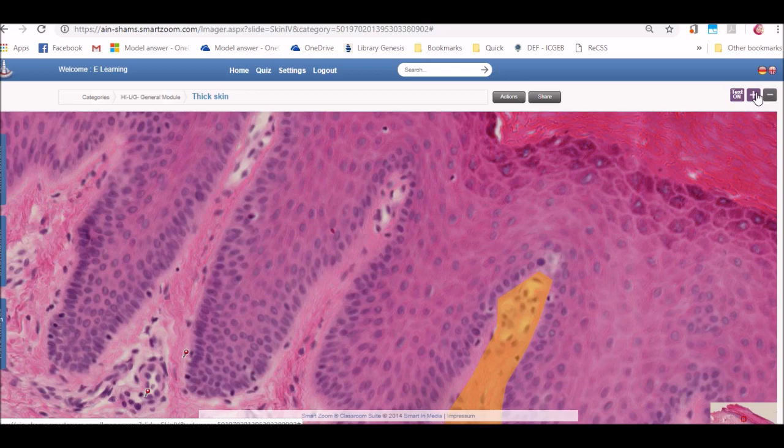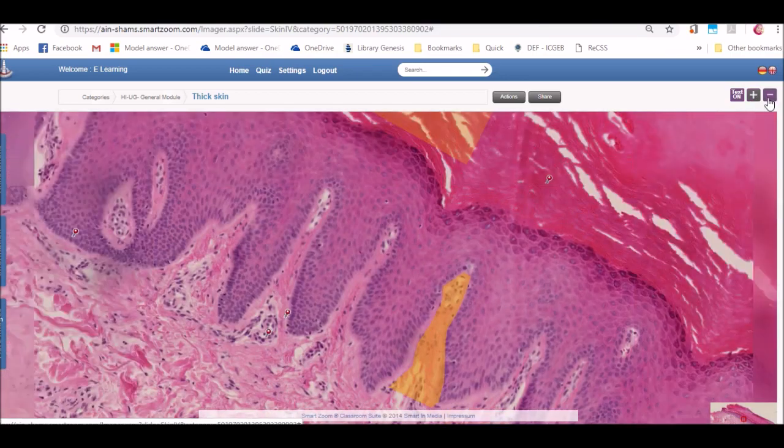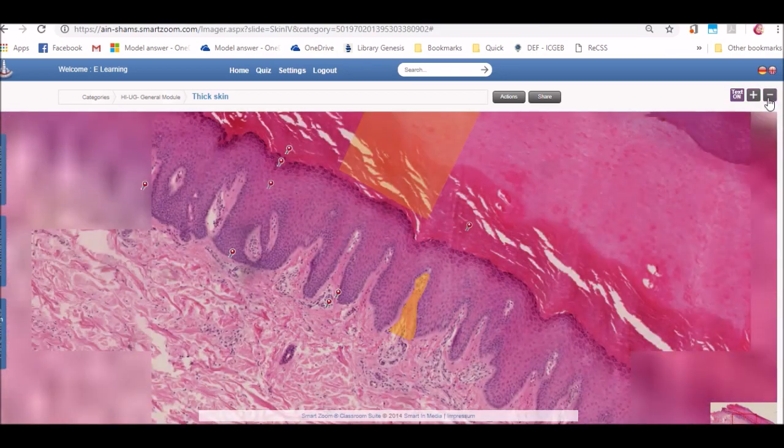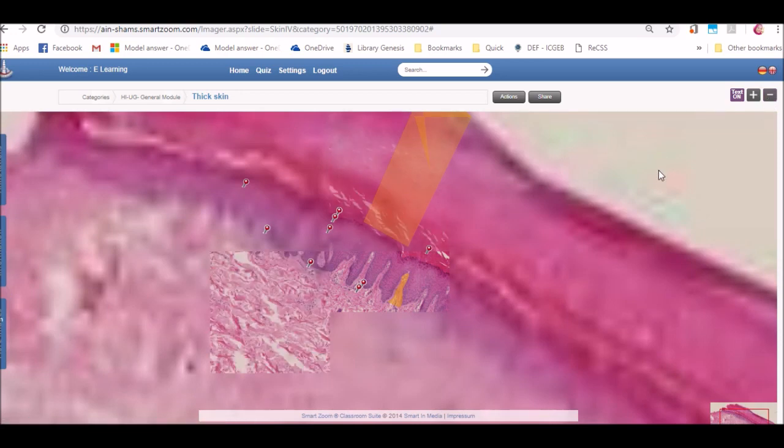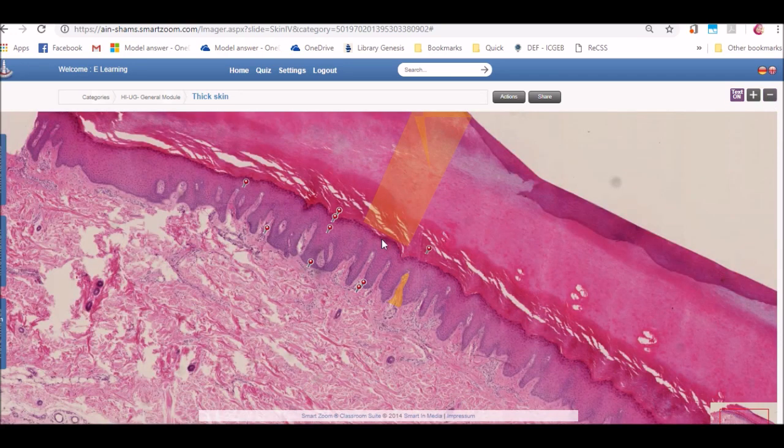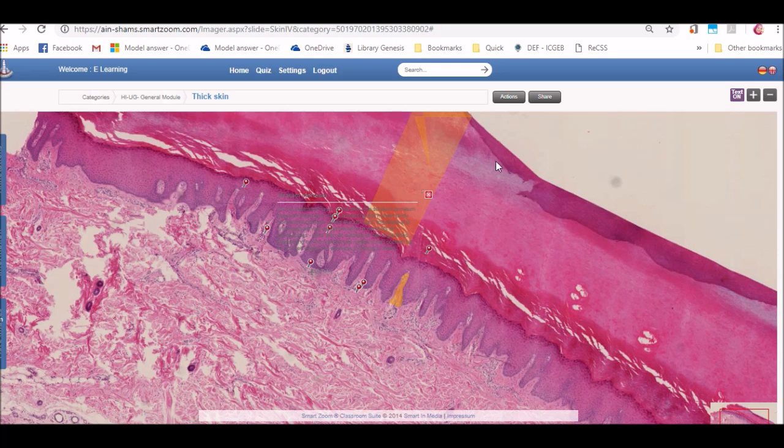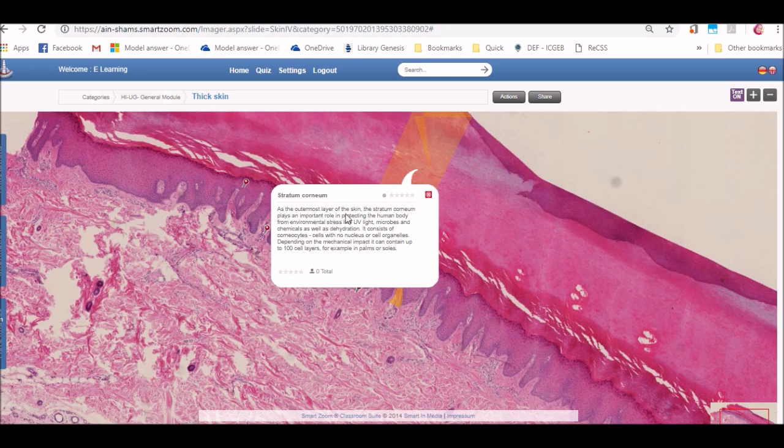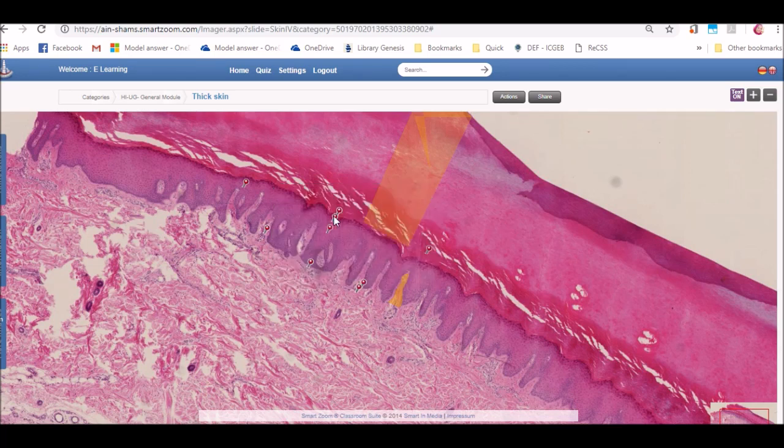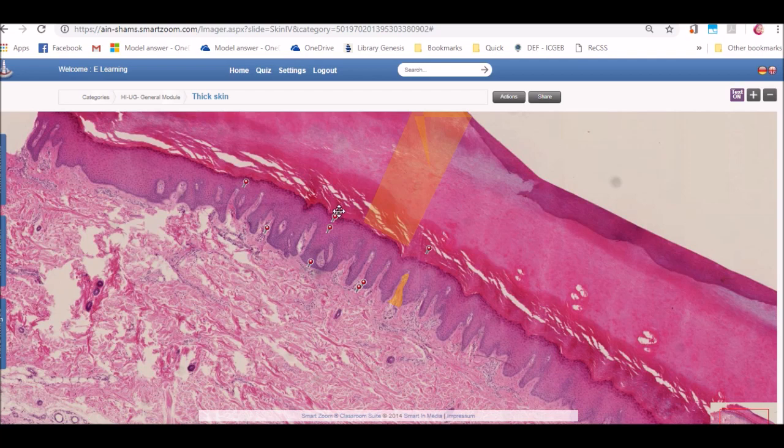As you can see, you will find a lot of annotations in the form of shapes shaded like this one, and pins like this one. When I click on any one of them, a box will appear containing the title and an explanation or a detailed structure of this annotation.